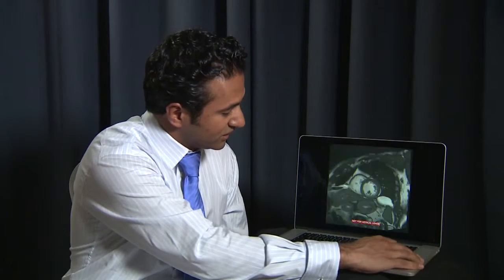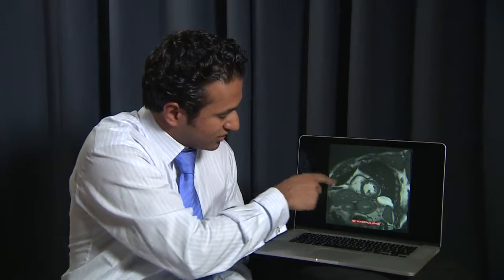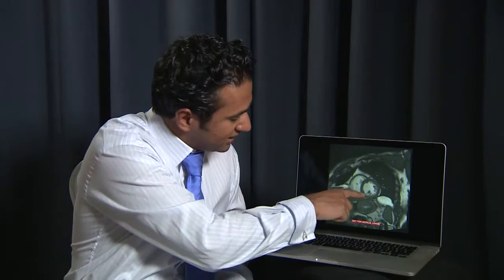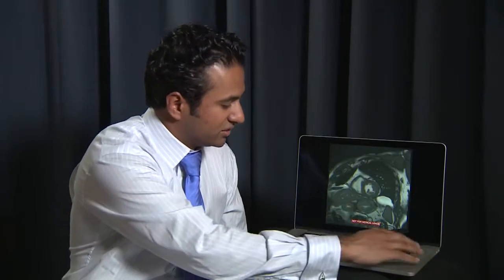It would not be worthwhile to revascularise in this case, but there would be other potential treatments that would benefit this patient. Here is another example — a short axis view, which is a cross section of the left ventricle. This is the right ventricle. The heart is beating okay, but just in the inferior part and the lateral part of the left ventricle, we can see it is not contracting as well as the other parts of the myocardium.